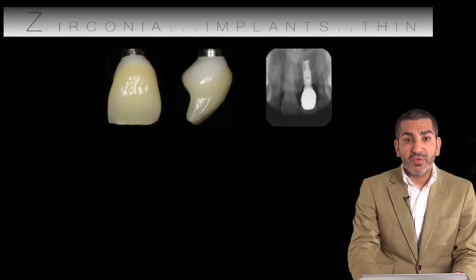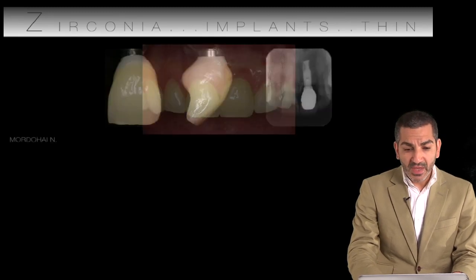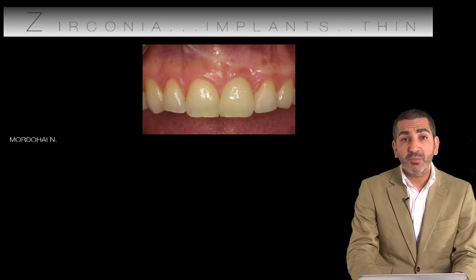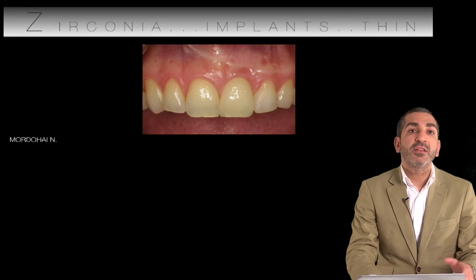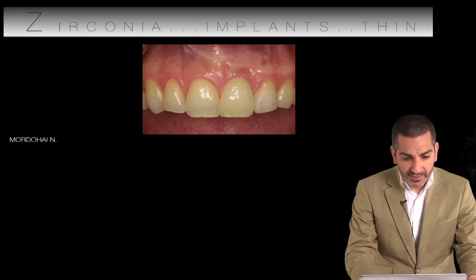So this is how it was restored. It was restored with a zirconium abutment and a gold screw, and this is the definitive restoration in place. With a lot of trouble, a lot of difficulty to get these two to match and get nice looking definitive restorations.